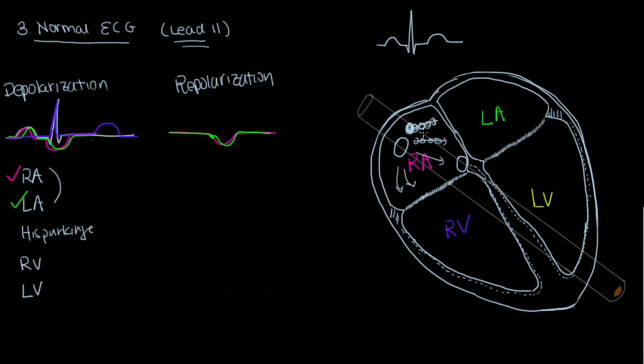And that's why when you see the overall movement of depolarization move in that direction, you see the positive blip. And when you see the repolarization in the same order, that's the same thing as a negative charge moving in the same direction or a positive charge moving the opposite direction. So that's why you get the negative dip right here.